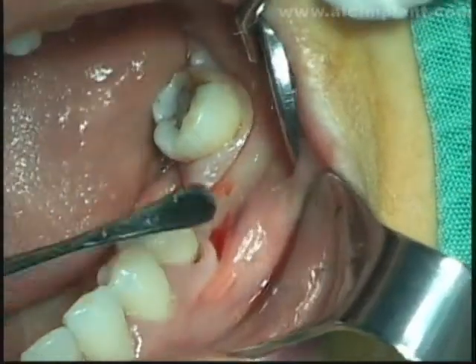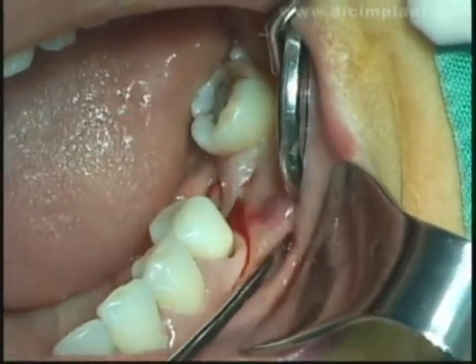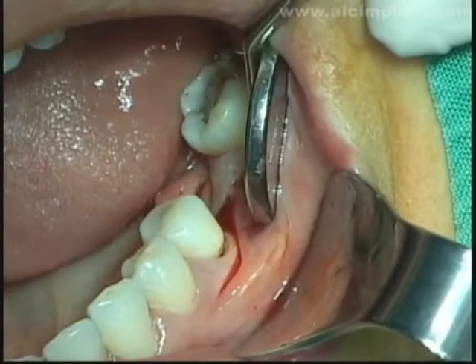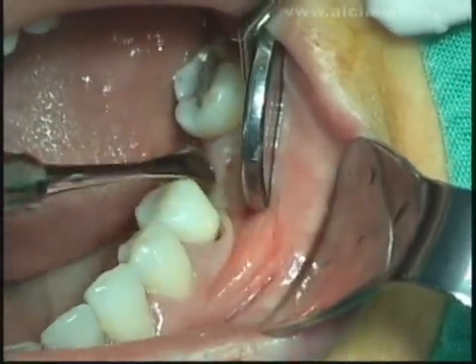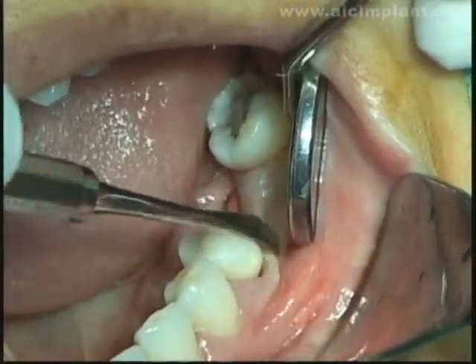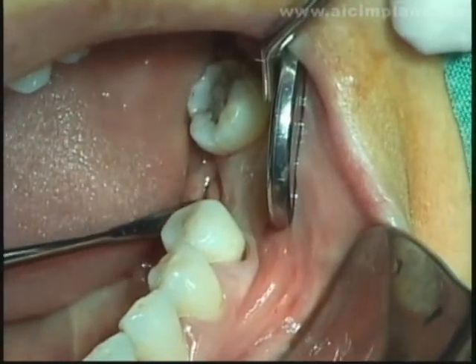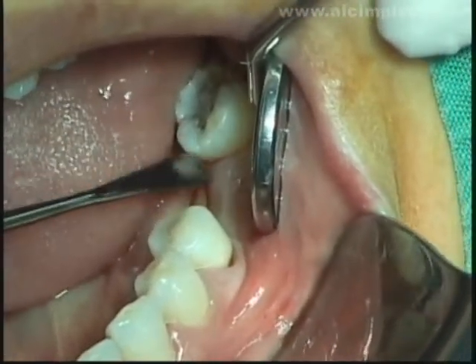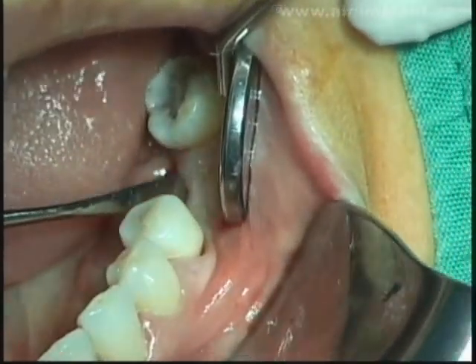The amount of attached gingiva initially appeared to be sufficient. By looking while moving the mirror, however, the attached gingiva was found to be inadequate. The mucogingiva is formed like this. Flapless surgery seems to be an option, but performing flapless surgery under this condition is actually impossible.